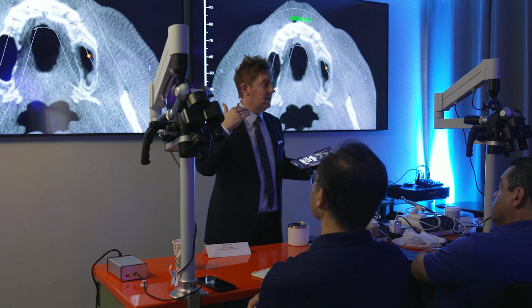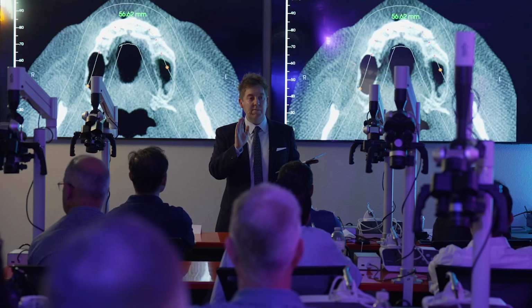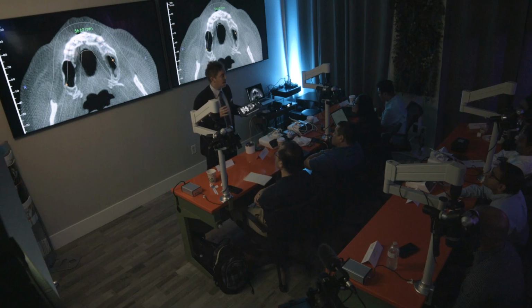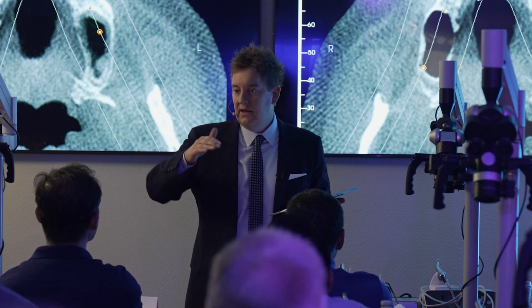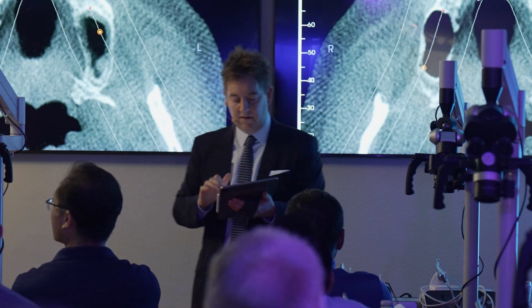Okay, what about in his mandible? Okay, we have the nerve in the posterior. And then anterior to the mental foramen, let's say that we go 3 millimeters in case the nerve comes and then loops back and exits the foramen. Is there much that we have to worry about? Maybe some terminal branches of a lingual artery that we can sometimes identify if we're right in the midline area. But other than that, not so much. If we're in the posterior mandible, maybe a lingual fossa, just based on his bone structure, and we'll look at that. And we're going to do Mark together, of course.